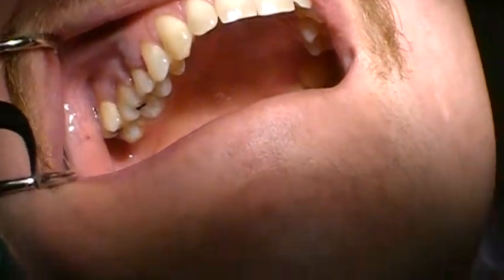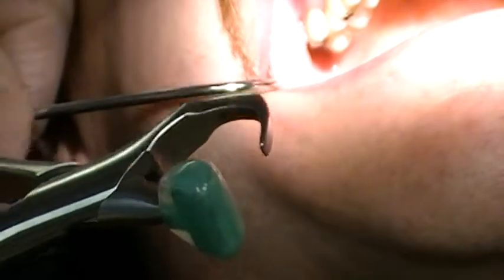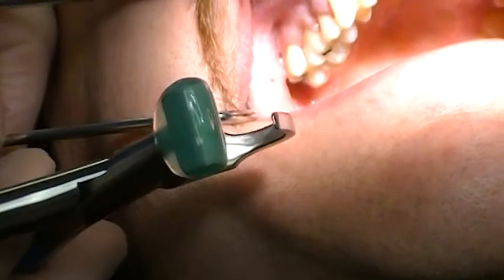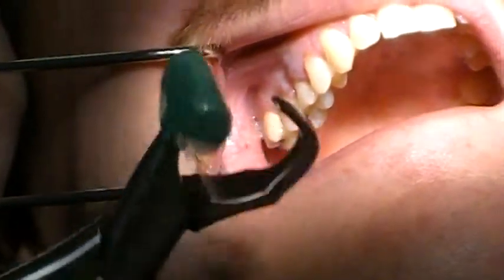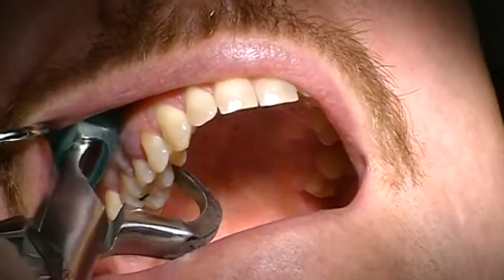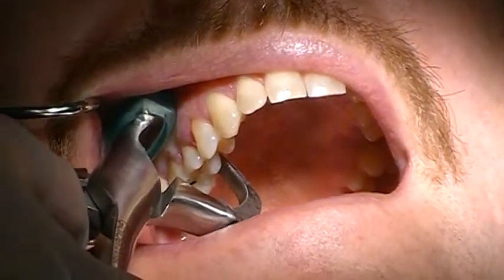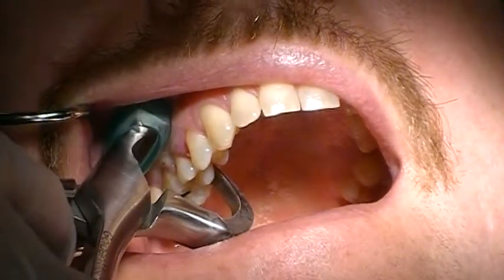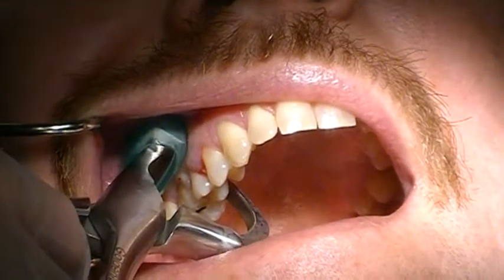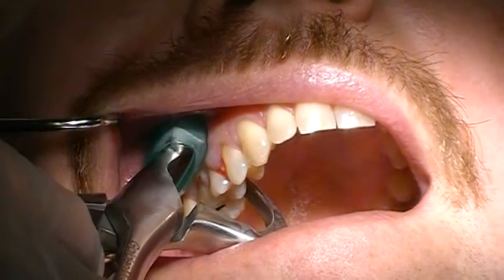The physics forcep has a green bumper on it. That bumper will be on the buccal or facial aspect of the bone, as far up the vestibule as possible. The flattened edge will engage the lingual part of the tooth. What I'm doing is holding the forcep rather lightly and rotating my wrist — there's no arm pressure. It's a simple rotation of the wrist.